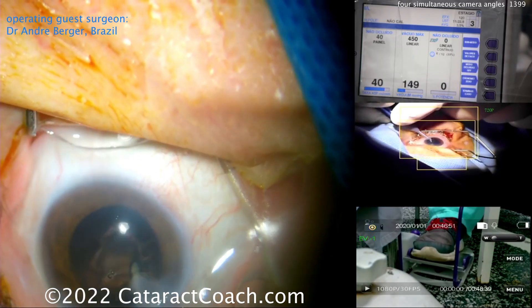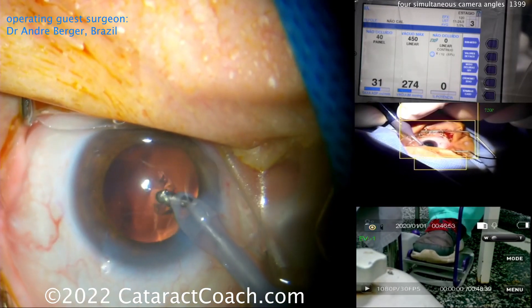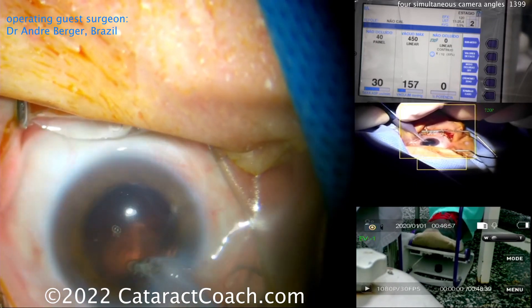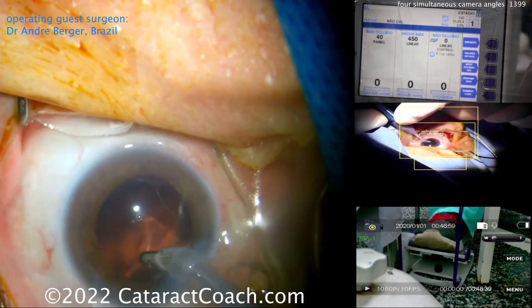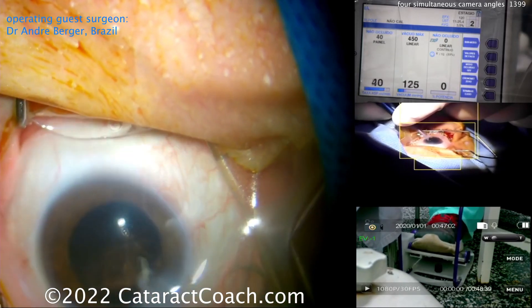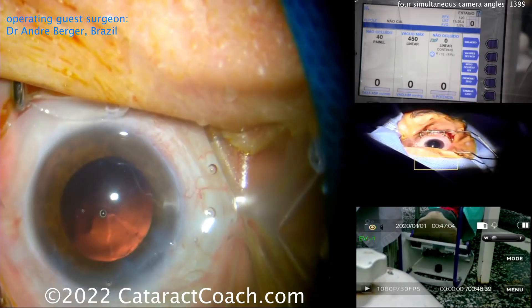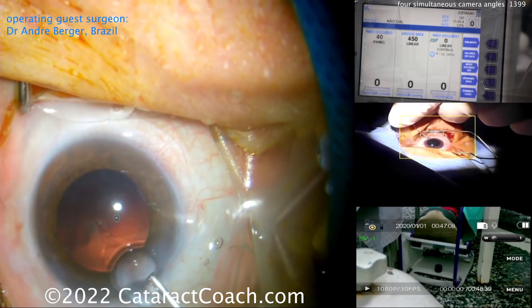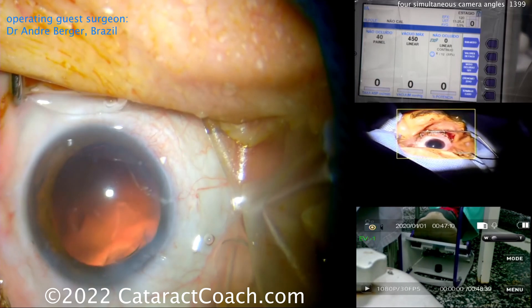Again modulating the amount of vacuum he delivers with that foot pedal — foot pedal goes up and down. Remember, the foot pedal is like driving your car: it's a gradient of the amount of vacuum or ultrasonic power. It's not an on/off switch. That's a common mistake residents make — they go on and off the pedal.